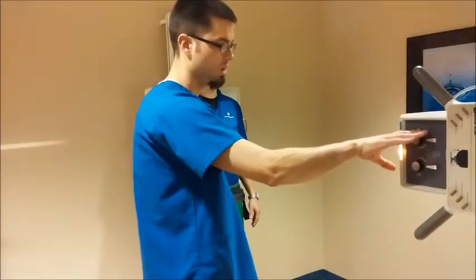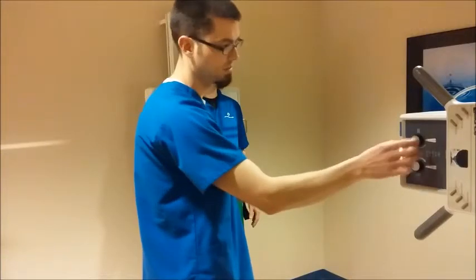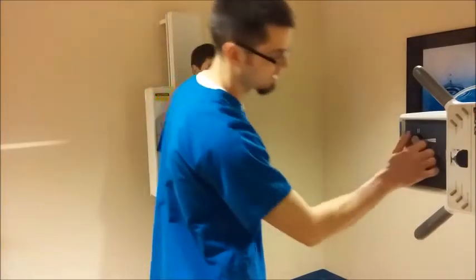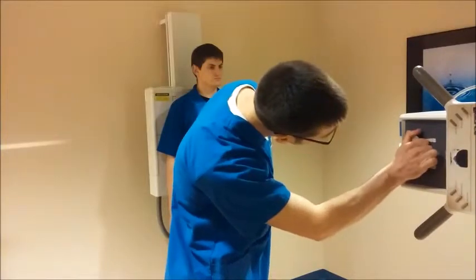This is due to not wanting to irradiate irrelevant anatomy, save dose to that, but we don't want to go in too far because you never know how far the spine is curved because it is for scoliosis screening. So we're going to collimate in here.